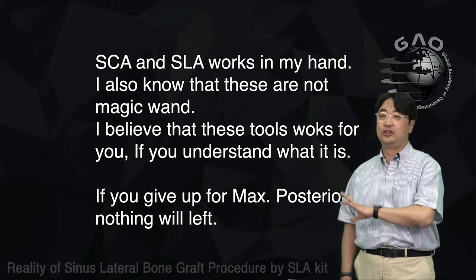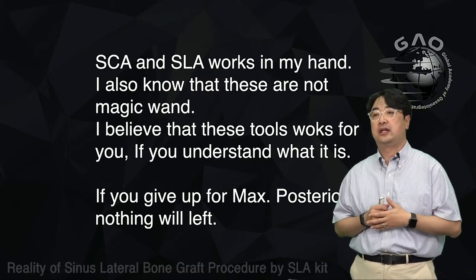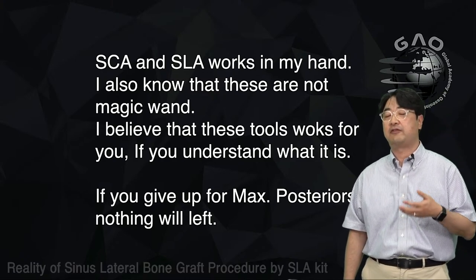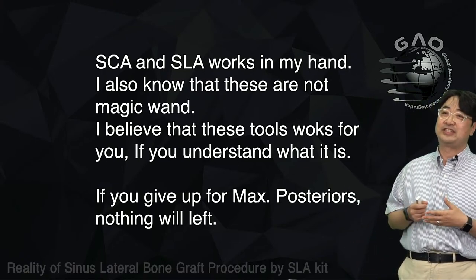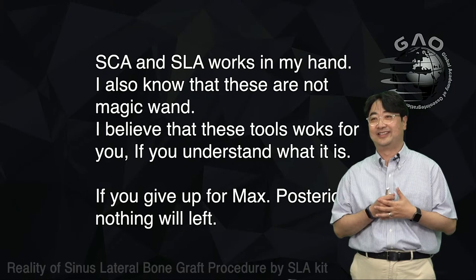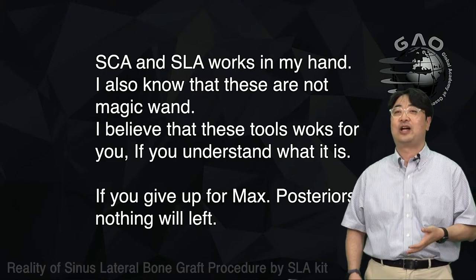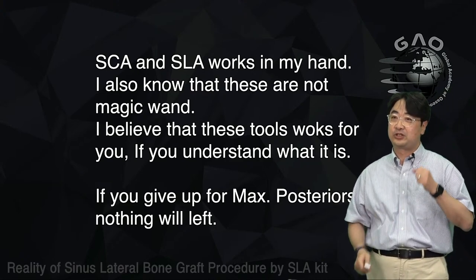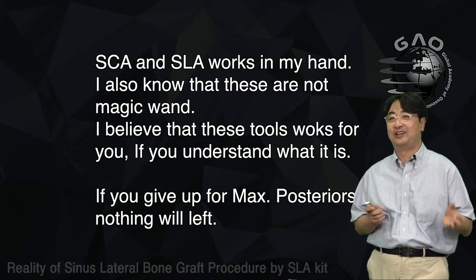You don't have to have all three. Either you can have the SCA and SLA or the sinus Orchid, right? But those kits save me a lot of time. And also it's good for my assistant. After surgery, they don't have to spend too much time cleaning those instruments and resetting up the instruments. Okay? But still, I also know that these are not a magic wand. You need to understand the mechanics and get used to this instrument. So I believe these tools work for you if you understand what they are. Okay, so try to use the SLA and SCA for the sinus graft at your next visit.